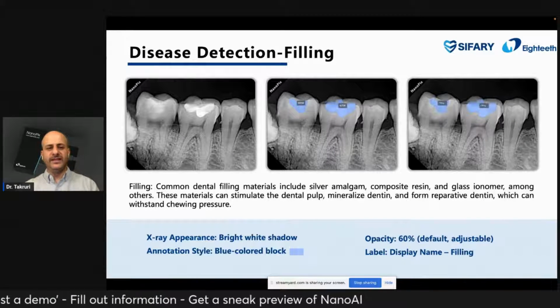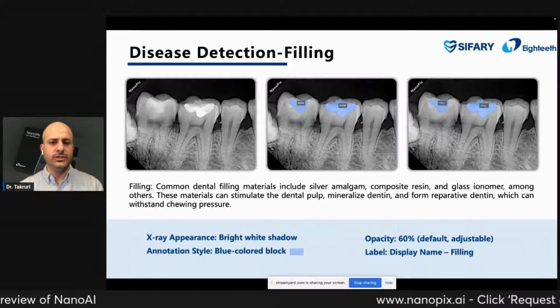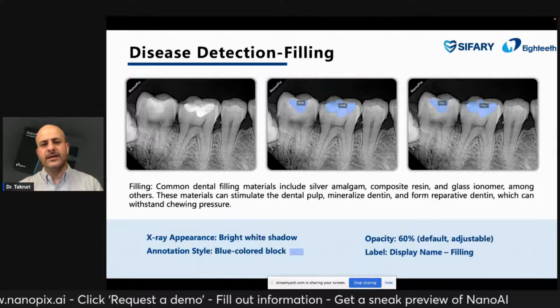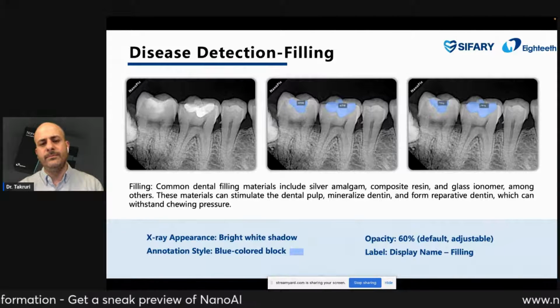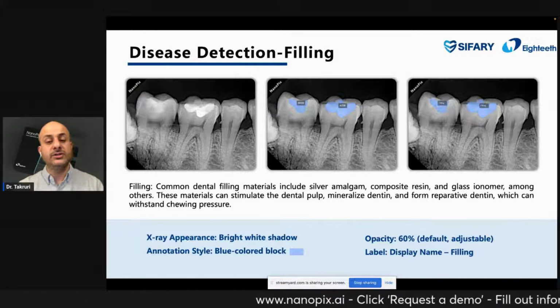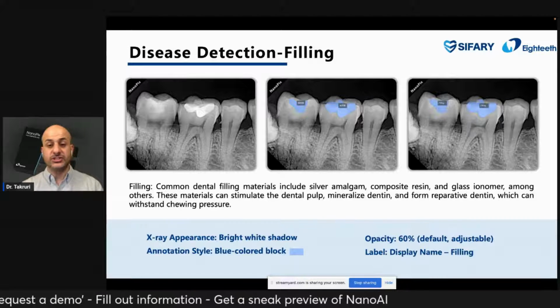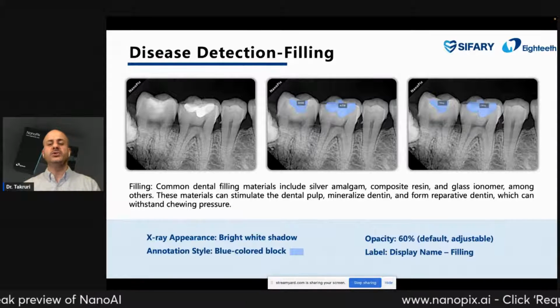Here, for example, you have a filling. For example, this patient has a pain on biting on this recently placed composite filling. And when you are coloring this and showing the patient how deep this filling is placed, your patient will be convinced to have vital pulp therapy or an endo procedure, or maybe a composite changing procedure. So your revenue will be increased.